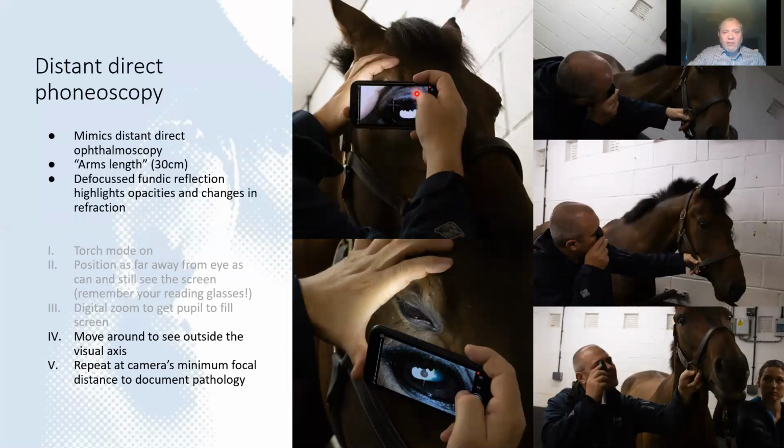Once we've got, so we can see the top left picture here, the phone's probably about 10 centimeters away from the horse's face at this point. We've zoomed in to fill the eye. We can see the pupil reflection, and then we're going to move it from different angles to try and highlight opacity and get them to move around.